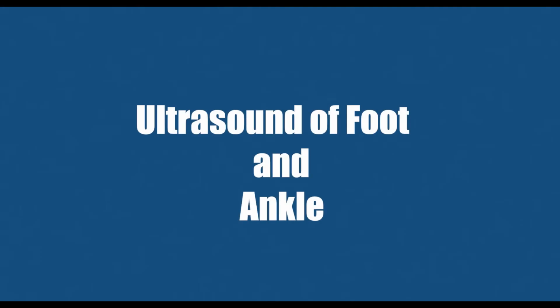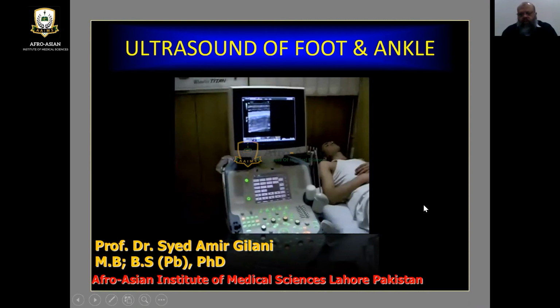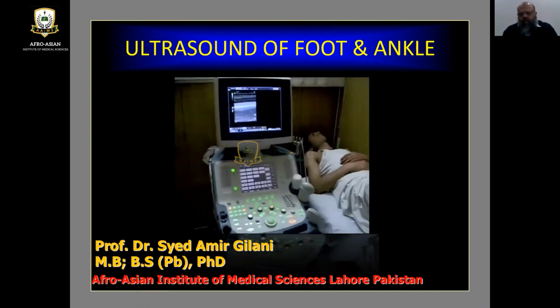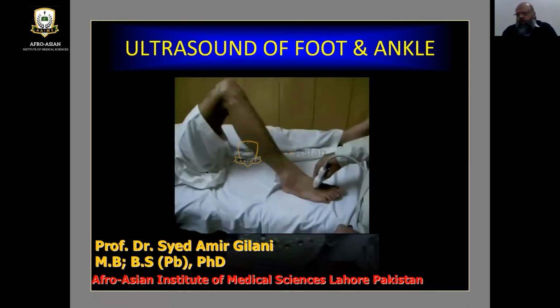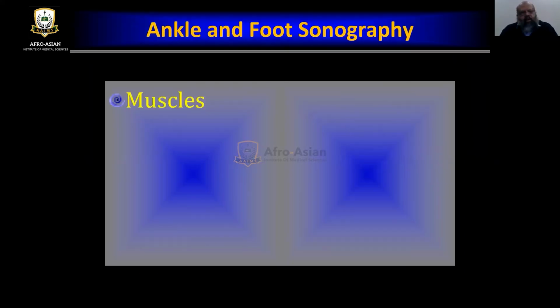Ultrasound of foot and ankle. This is how the patient will be lying. The right side of the patient on the couch, the patient will be supine. We have divided ankle sonography into 4 parts.